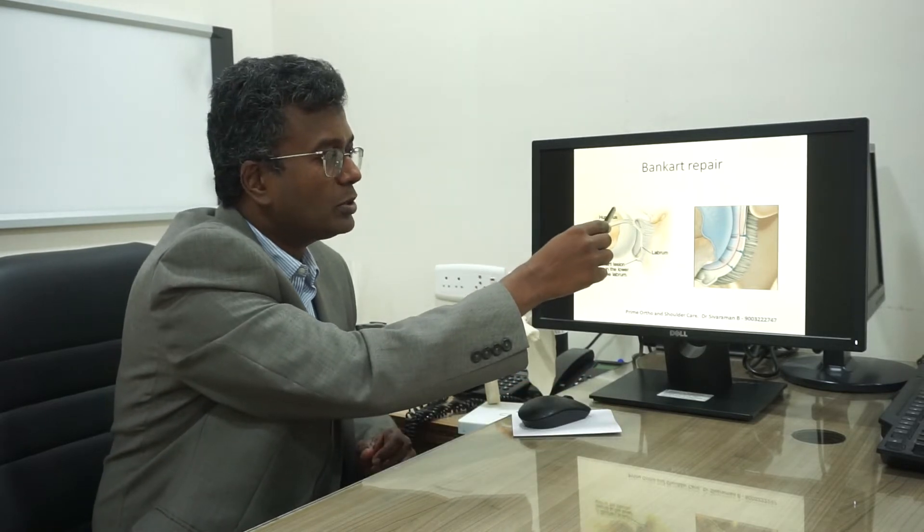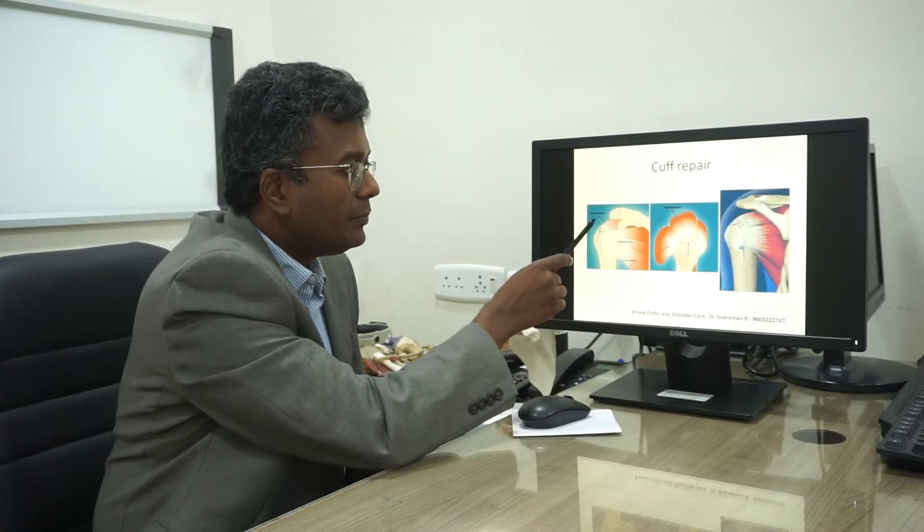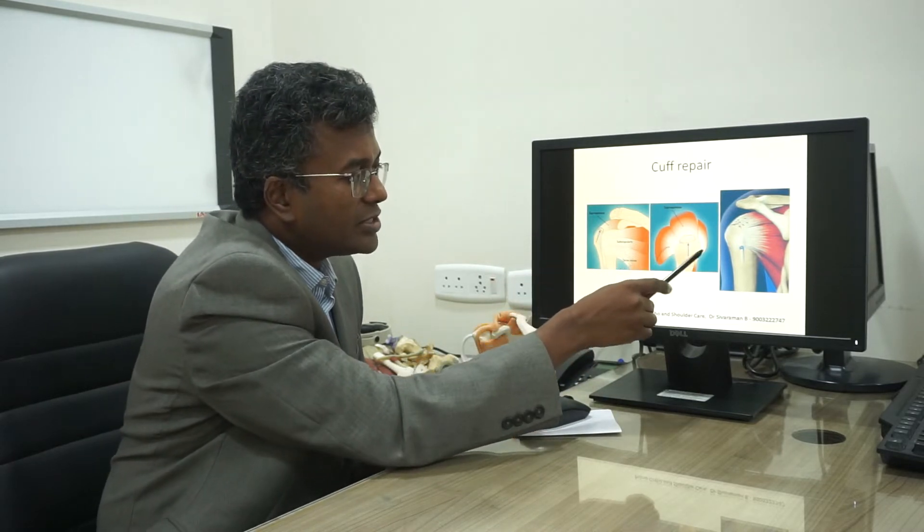We also do this along with a remplissage, in which we attach the capsule at the back of the shoulder as well. The next and most common surgery we perform is the rotator cuff repair, where the torn cuff muscles in the shoulder are reattached.